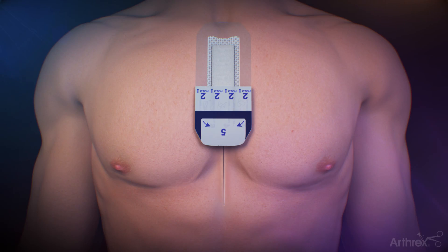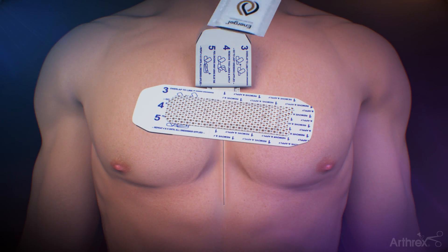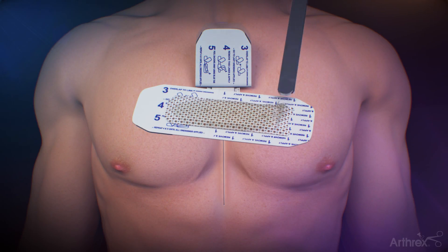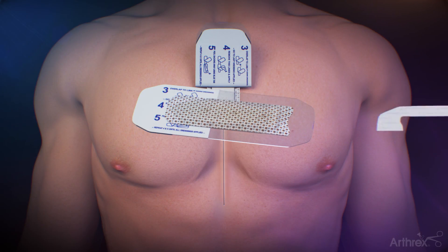To accommodate coverage of larger incisions, link an additional FlexiFit dressing to the first by folding back the liner labeled 2. Repeat adding Energel to the second dressing, then remove the liners labeled 1 and place on top of the distal portion of the first dressing.